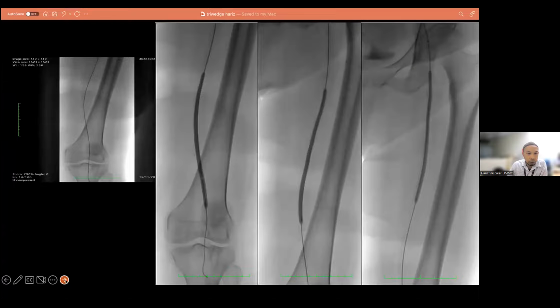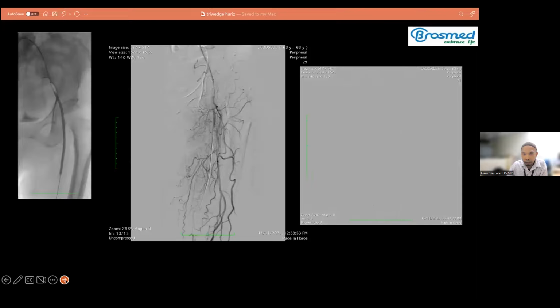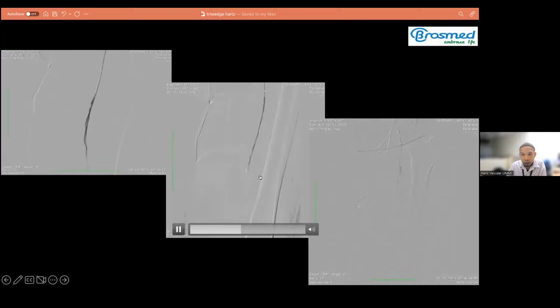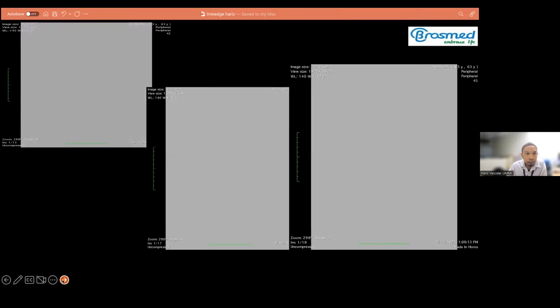and also putting... When I did this case, I think eventually they put in a stent. So this is how it looks. Unfortunately, it's not a good angiogram, as I think some of the clot has probably showered down after the beginning. So the stent was inserted to trap some of the residual thrombus and then post dilate. So there's still residual clot there.